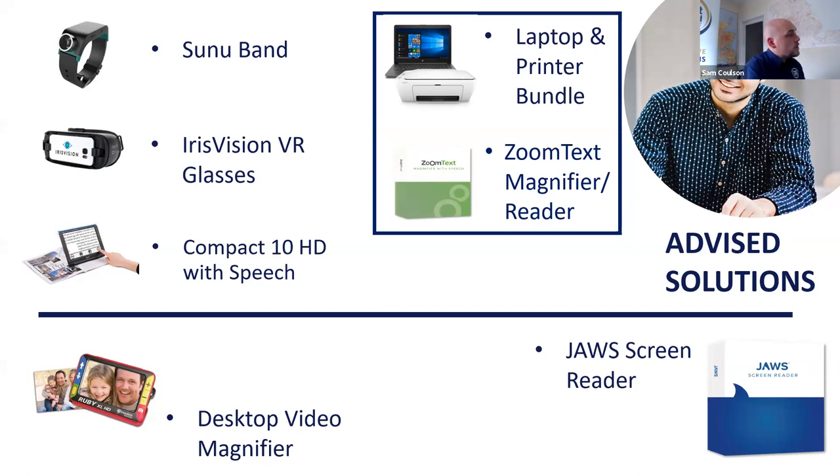Magnifier Reader. This is another piece of software, magnification software. As it says, this will magnify everything on Sandeep's screen, making it much easier to navigate. It also massively reduces the strain on the eyes if they're trying to work hard to look at a monitor for a certain amount of time.